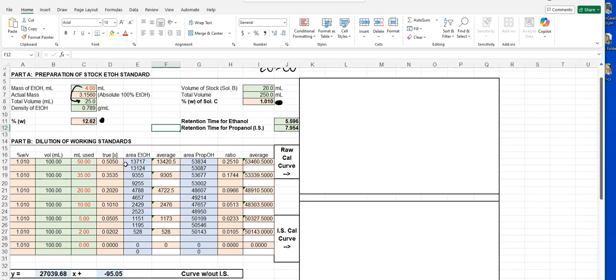So what I'll do, like before, I will click on 50/50. I'll hold the control button on the keyboard, Ctrl, control. All right. So 50/50, and then I'll click on the average that I want to bring in. I just select really random numbers here. I know I'm going to modify it a little bit later, but I'm just selecting two numbers so that way I can at least get Excel to build some type of a chart.